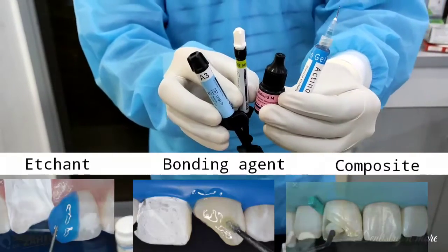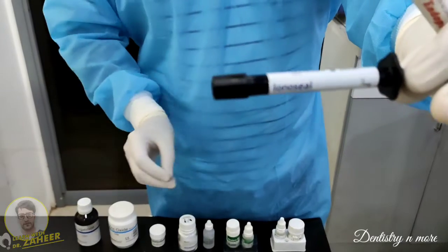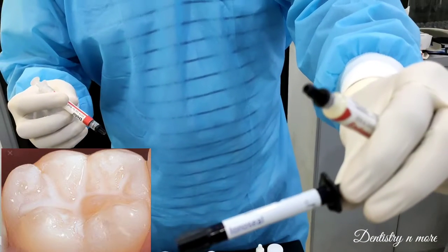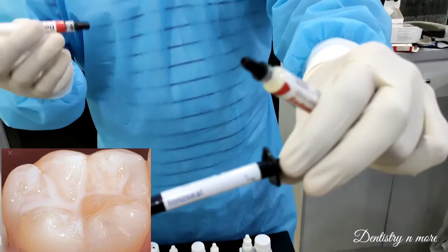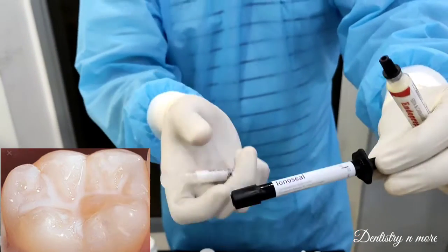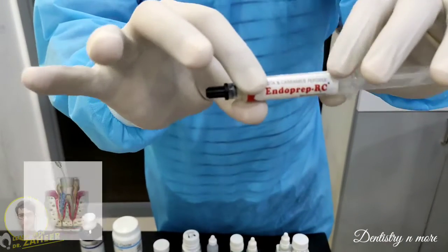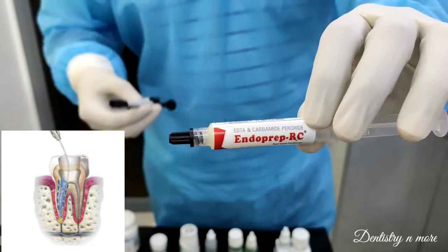This is Ionoseal — a light-curing, ready-to-use glass ionomer composite cement that can be used for various restorations and fissure sealants. Ionoseal is basically used as a fissure sealant. Next we have EndoPrep RC, which is an EDTA and carbamide peroxide containing root canal irrigant and conditioner.